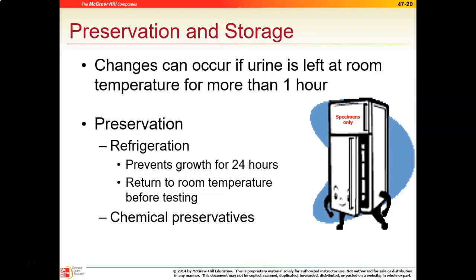Okay, so the time frame here that we need to look at is that if you're going to do your analysis, if it's more than an hour, put it in the refrigerator. If you can get everything done within an hour, that's fine. You're not generally going to hold urines overnight. Most of the time they're going to do the analysis, and if they need to send it off for culture, they will prepare that, and then things will get sent off within the day's time frame.